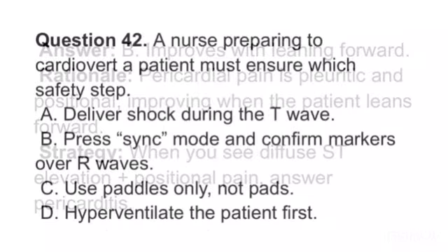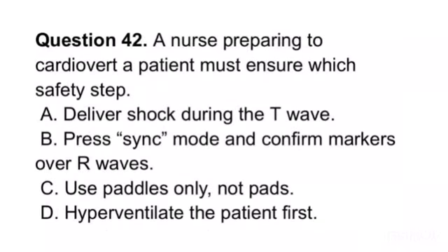Question 42. A nurse preparing to cardiovert a patient must ensure which safety step? A. Deliver shock during the T wave. B. Press sync mode and confirm markers over R waves. C. Use paddles only, not pads.